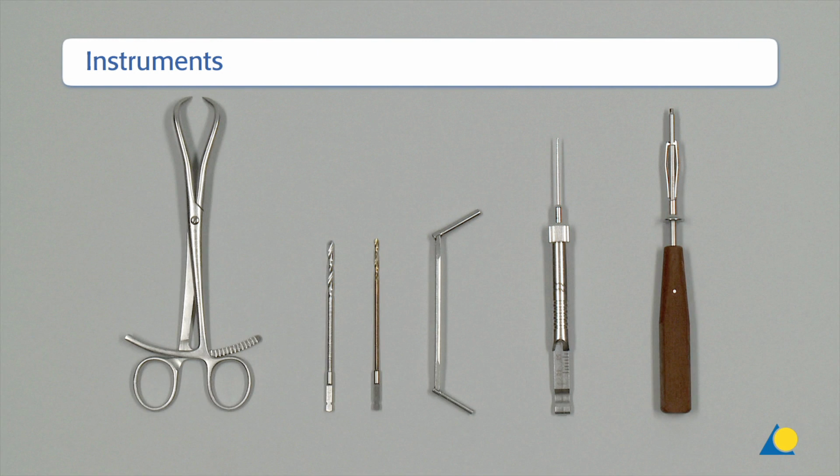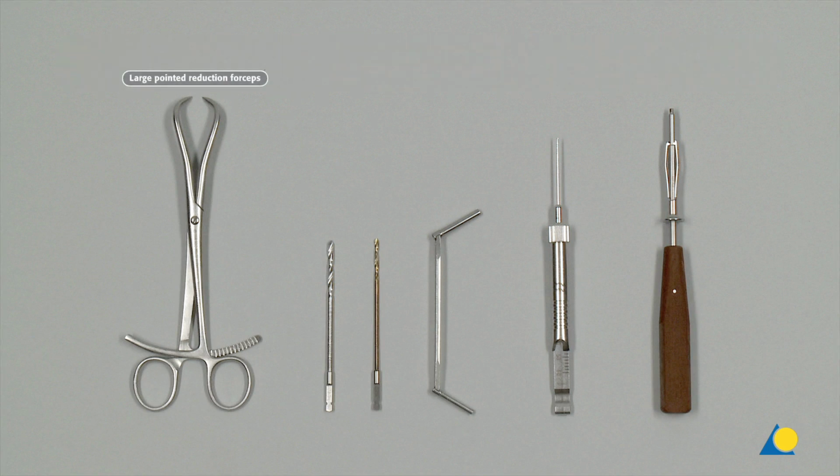The required instruments are the large pointed reduction forceps, the 3.5 mm drill bit, the 2.5 mm drill bit, the 2.5/3.5 mm universal drill guide, the depth gauge, and the hexagonal screwdriver with holding sleeve.